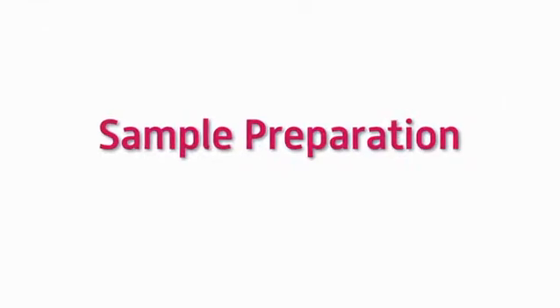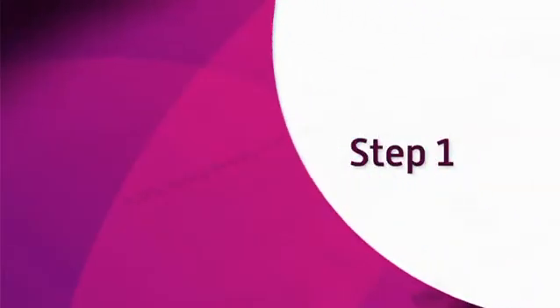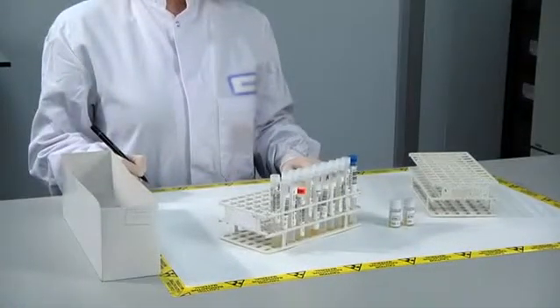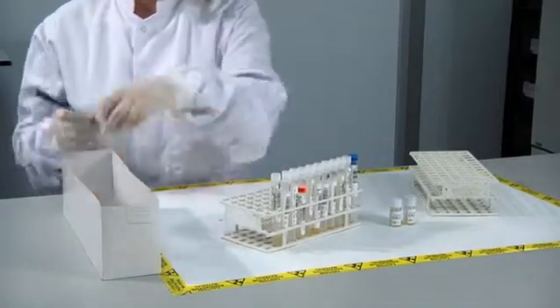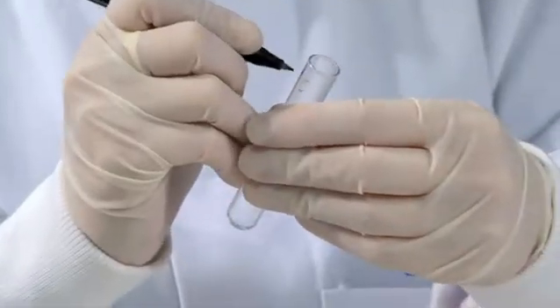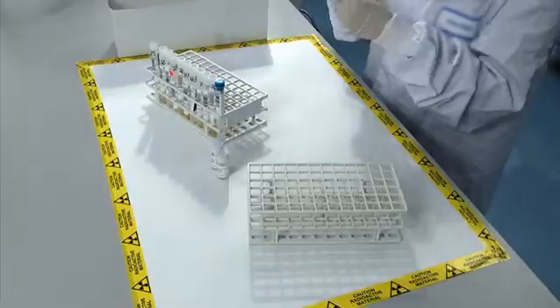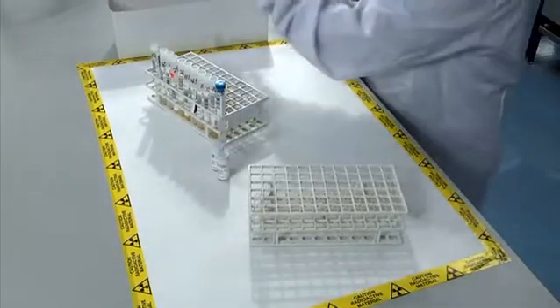Sample preparation. Step 1: Prepare labeled glass or plastic tubes, one for each control and sample. Do not label tubes for the calibrators.